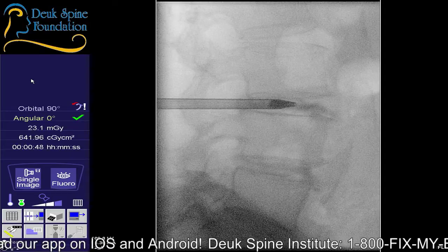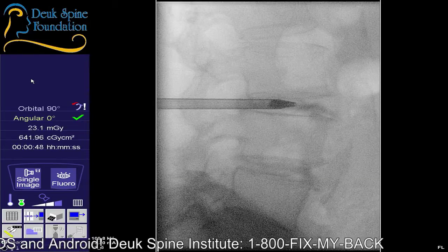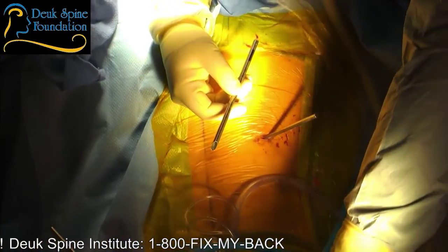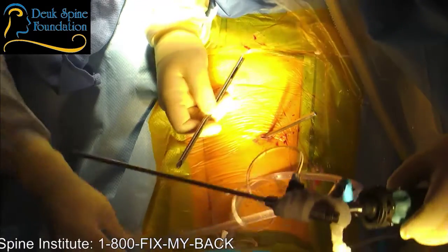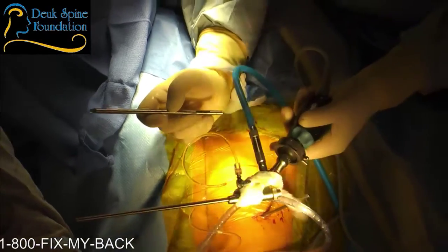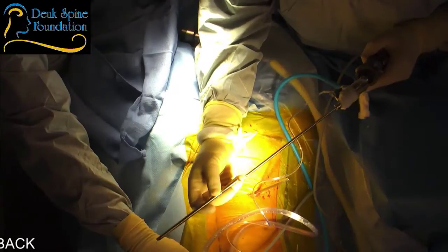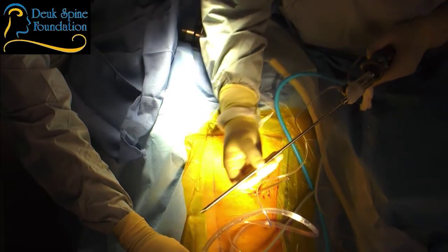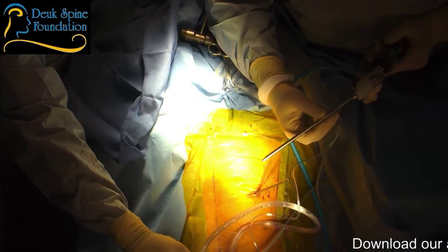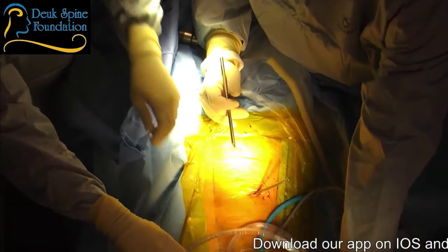Again, L3-4. Now, for those of you who came late, let's show them the tube that we're doing the whole surgery through. You all see the tube? So I'll just show you this real quick. Can you watch the suction tube? Basically what I'm doing, folks, if you can see, this is the endoscope, camera, light source, irrigation. I'm basically putting this endoscope down, and look what happens. It pops out the end right there. You see that? And I'm doing the surgery way down here. So that's how endoscopic surgery is done.